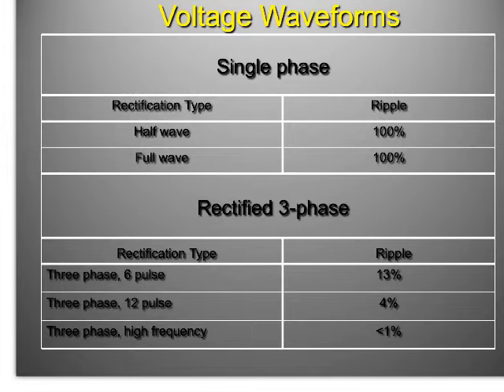But it is not the kind of power that we want for the inner workings of the X-ray tube. We need a direct current or something very close to it for the X-ray tube, because we only want the electrons to hop in one direction, and that is from the cathode to the anode. Okay? So we're going to have to rectify or correct the power frequency before it comes into the X-ray tube.